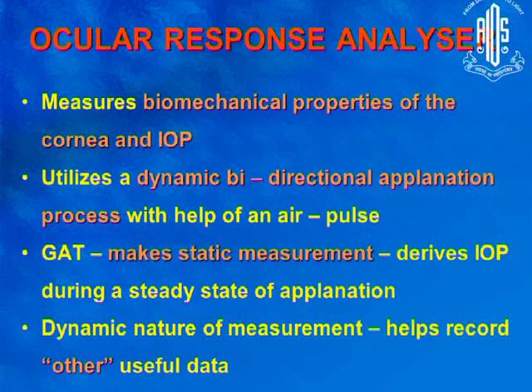How does the ocular response analyzer help us? It measures the biomechanical properties of the cornea and also gives the IOP. It utilizes a dynamic bidirectional applanation process with the help of an air pulse. It works just similar to the non-contact tonometer, except for the fact that the non-contact tonometer just flattens the cornea with the puff of air.